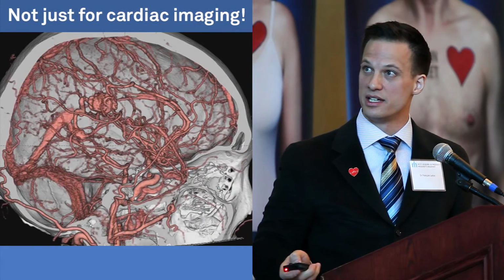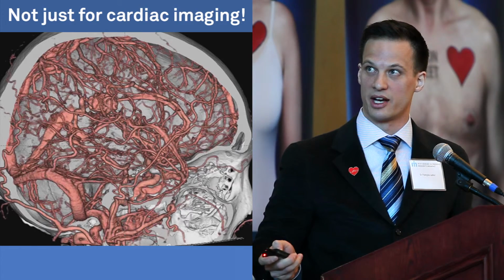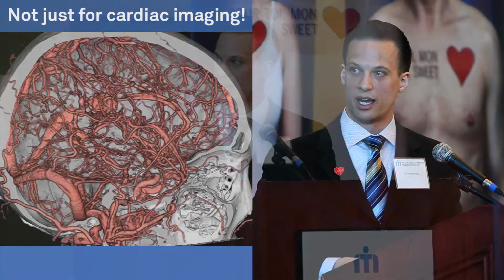And once it stops, you can see here that this is this tangle, an aneurysm or a vascular malformation. And you can play this slowly, and you can see exactly which vessel is coming in to touch that vascular malformation. So to go back, why is this important, fancy technology, but why is this important?